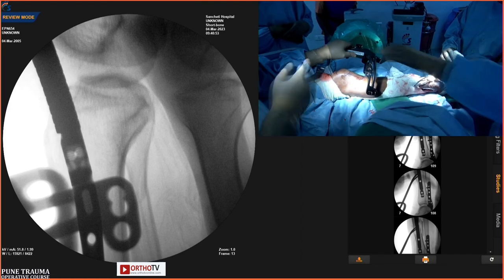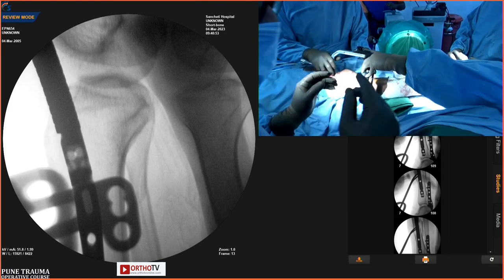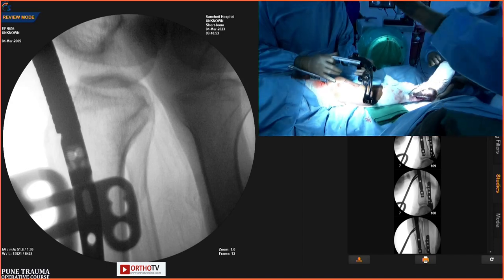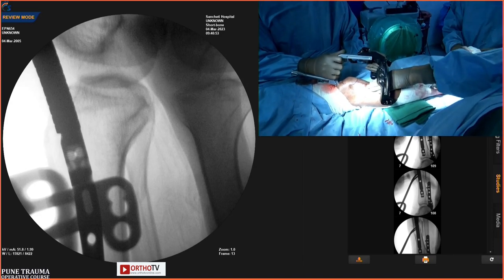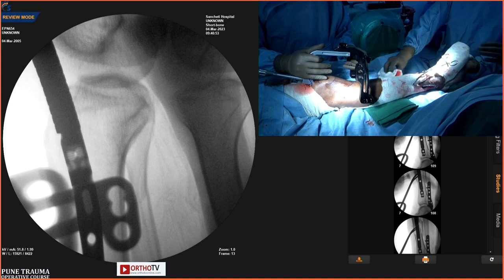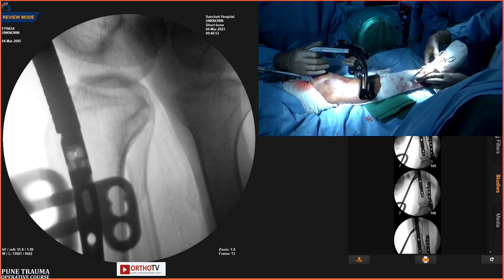Good morning, sir. My question is to the panelists. If an interlocking nail was not an option and we were supposed to use a plate, you are telling us to first fix the fibula, then plate the tibia, then do the final tightening of the fibula, then the final tightening of the tibia. Is that the process, or is the process going to change? This is a comminuted fibula and tibia.